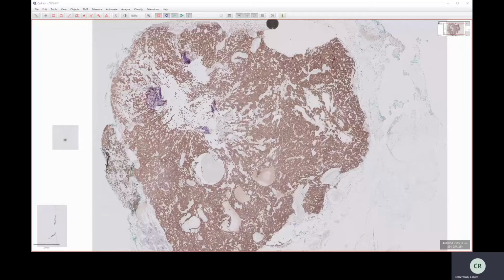And that has an added benefit. You can look at exactly what tissue type, exactly what cell you're looking at, because IHC might stain the different cell types differently, but you might only be concerned with how it's staining the cancerous cells, for example, and not really be interested in how it's staining the other cells in the background.